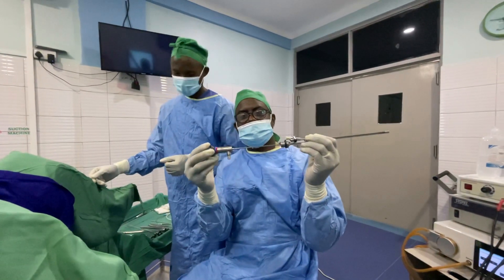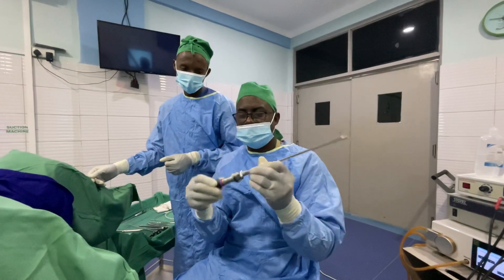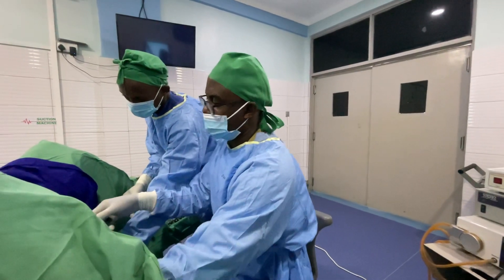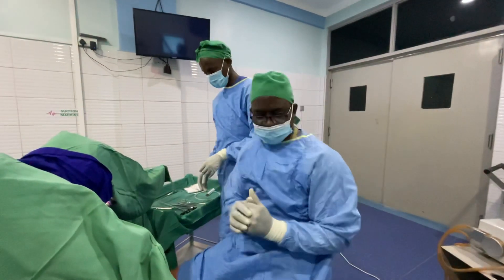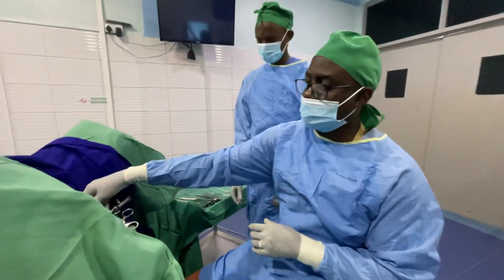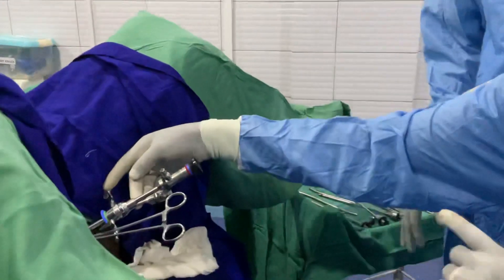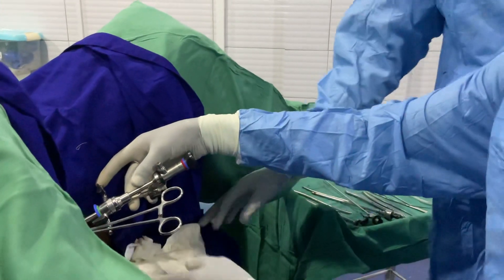After inserting the external sheath, I connect the working channel of the equipment. This is a 2.7mm telescope in the working channel, now connected. The next step is to connect the fluid, so I connect fluid from the pump to the inlet and then connect another tube for the outlet.